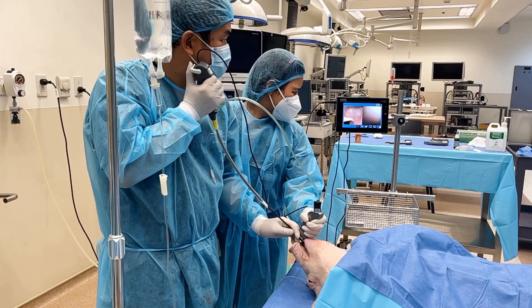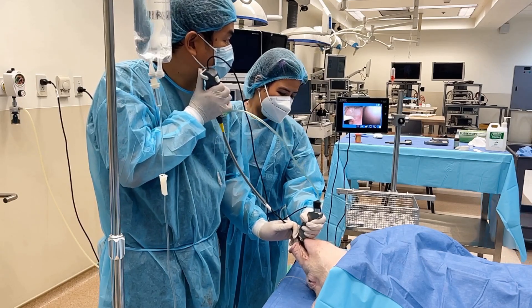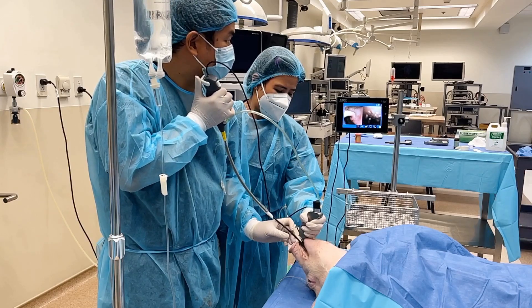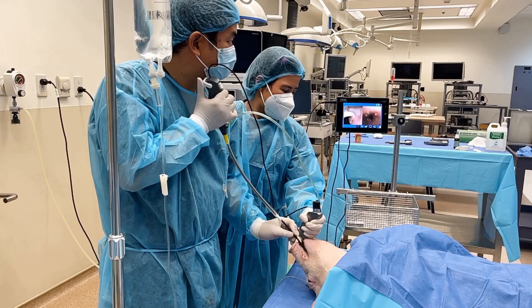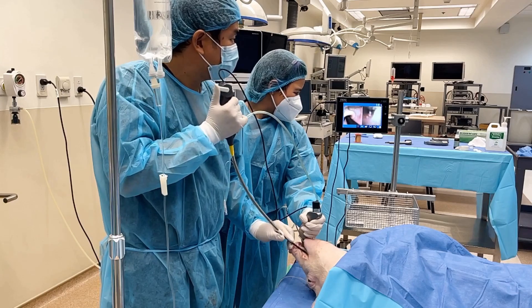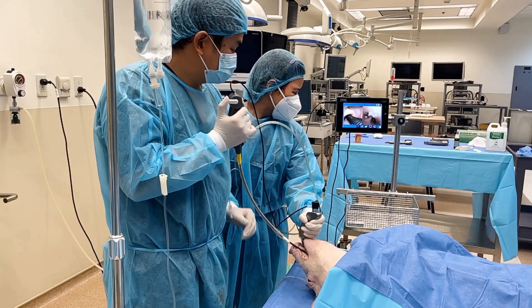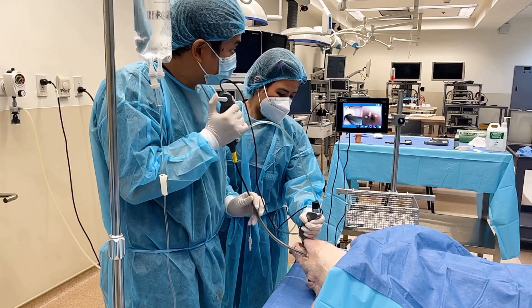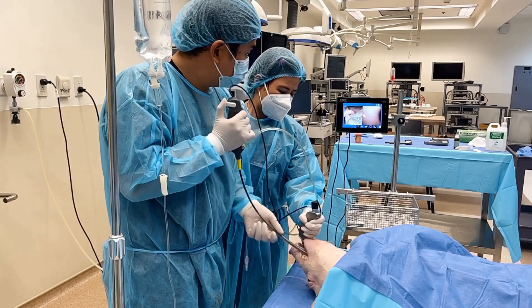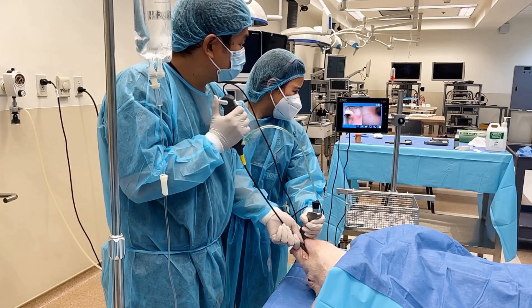You could also perform this technique when you don't have sufficient view with the video laryngoscope — this is video laryngoscope assisted flexible intubation. Once you've entered the larynx, advance the flexible scope until you're near the carina, then railroad the endotracheal tube to intubate.